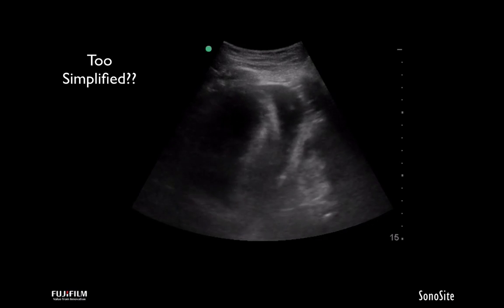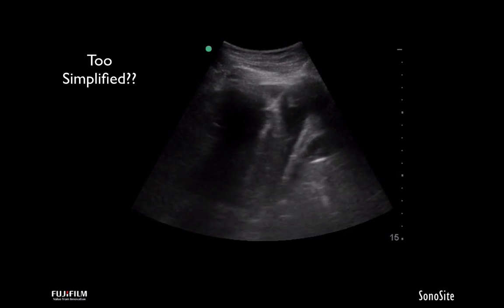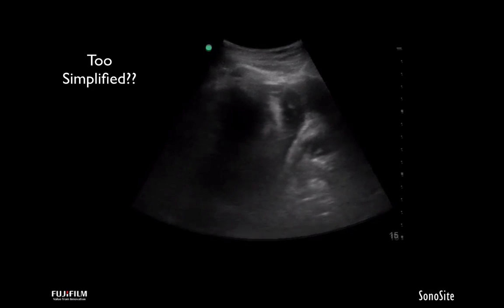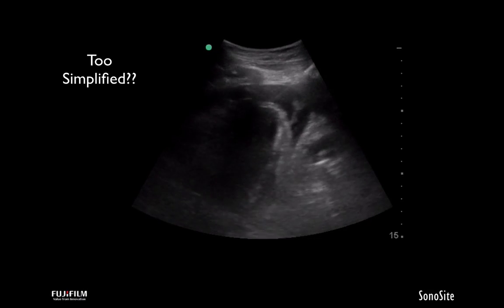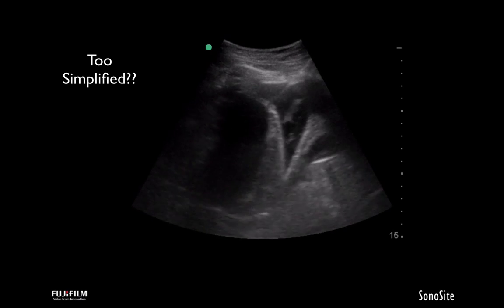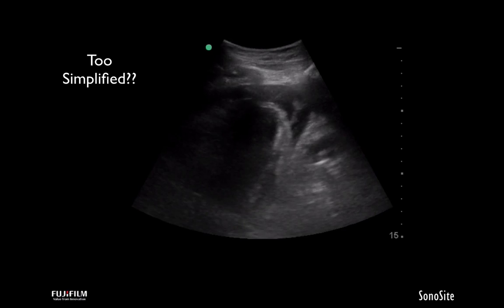So the beauty of that space is I can visualize it, I can get into it, which is surprising, but you'll see the needle coming in. I'm a little too deep. I'm touching the heart. I can visualize that. I pull back and slide that wire in. And by doing that, it's a fairly not difficult procedure. Again, visualized, safe, you know what's going on.